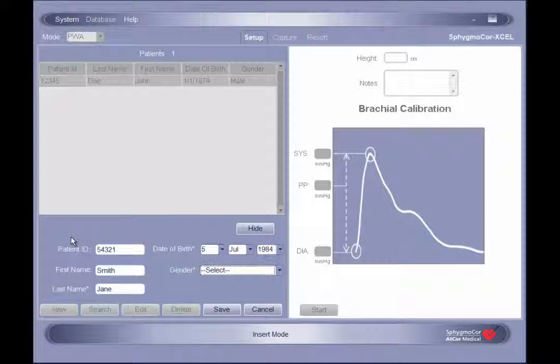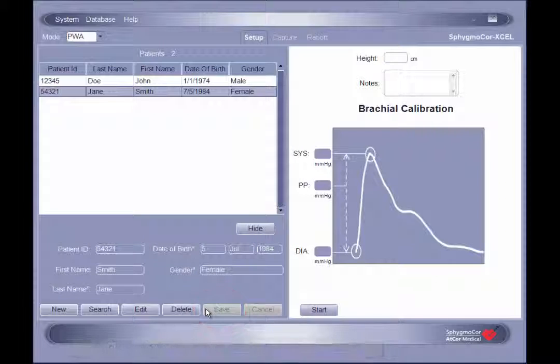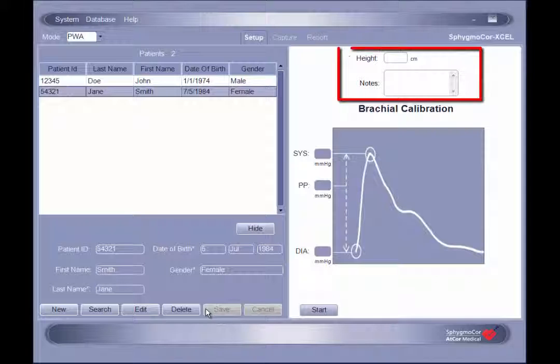Required fields are noted with an asterisk. As few as a single character can be entered into any field, with a maximum of 10 characters for the patient ID and 25 characters for the last and first name fields. On the right-hand side of the setup screen, there is an option to enter the patient's height. There is also a notes field that allows for free text entry.